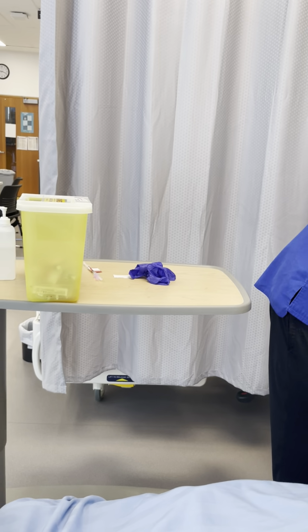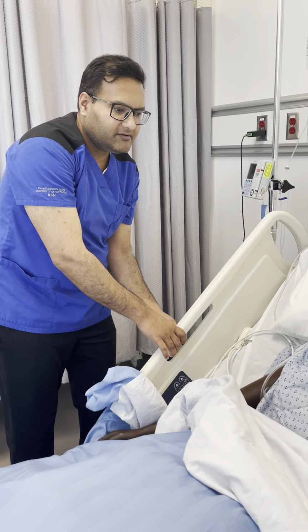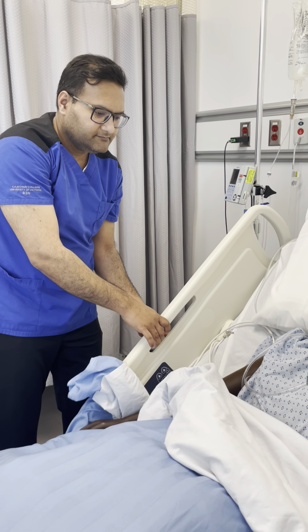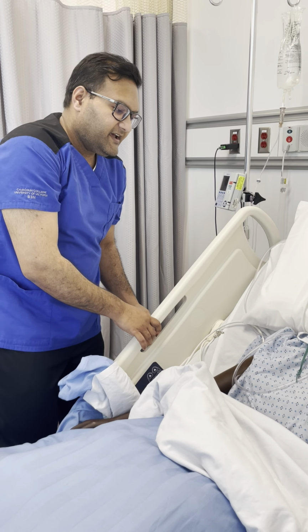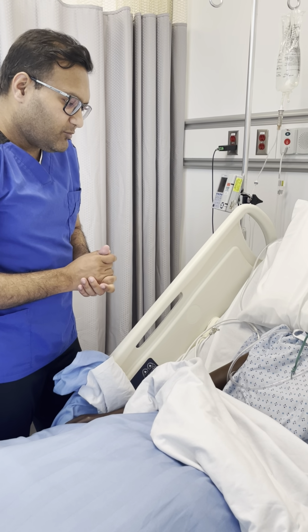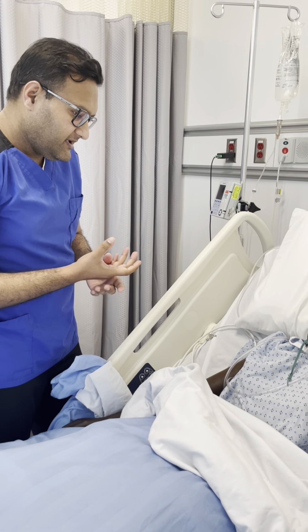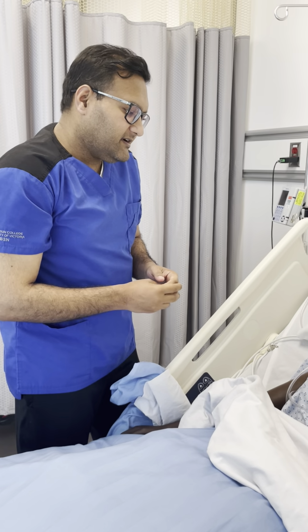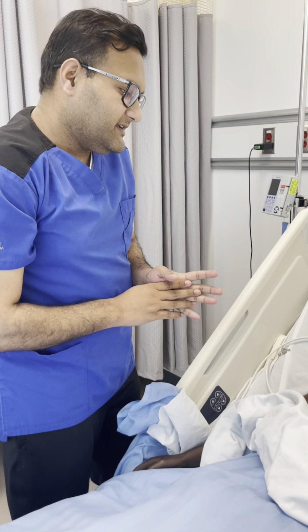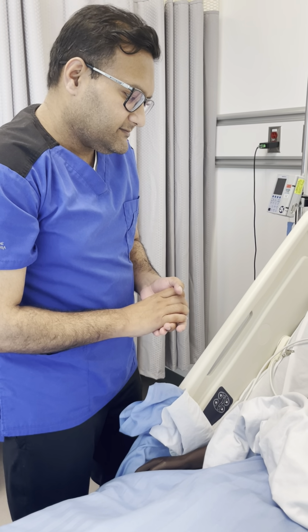For maintaining stability, I will have the bed raised. Now, Pat, I'm going to be applying morphine intramuscularly as an injection. Now for this, it is going to help with your pain that you've mentioned to me. Do you have any questions about this medication? Nope, all good. Thanks. I've had it before.